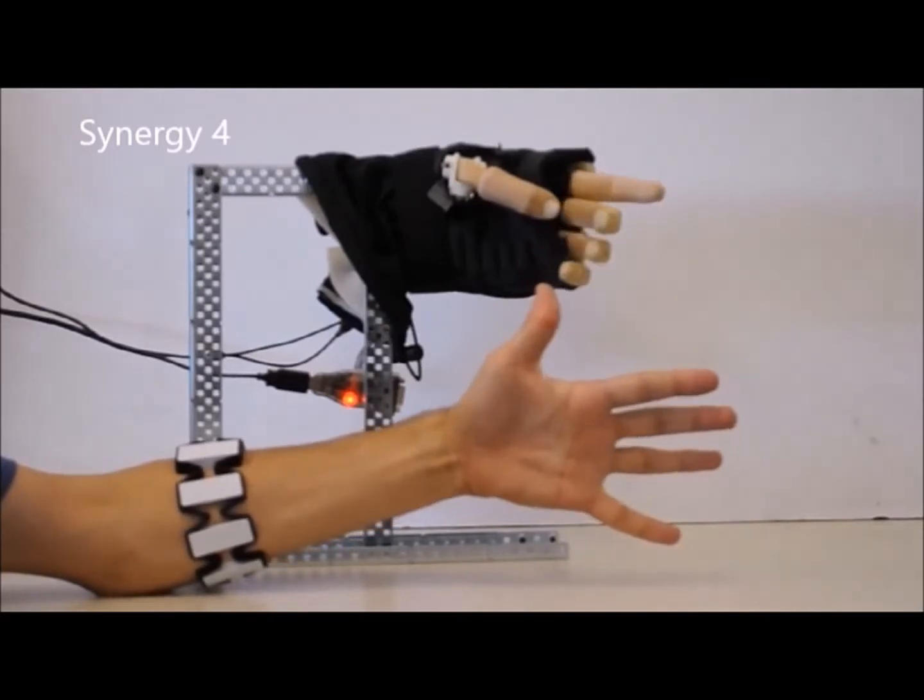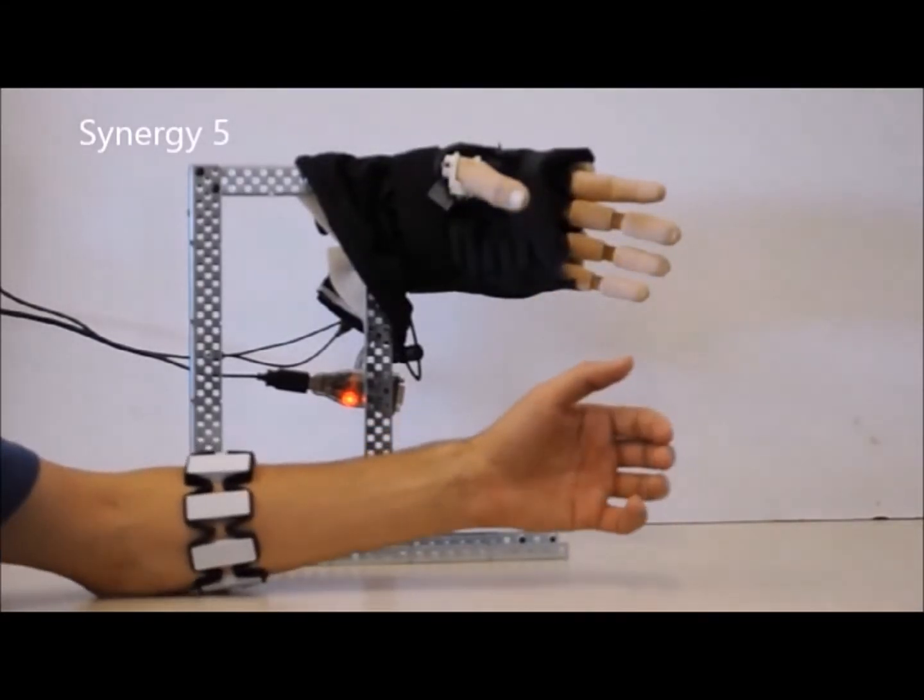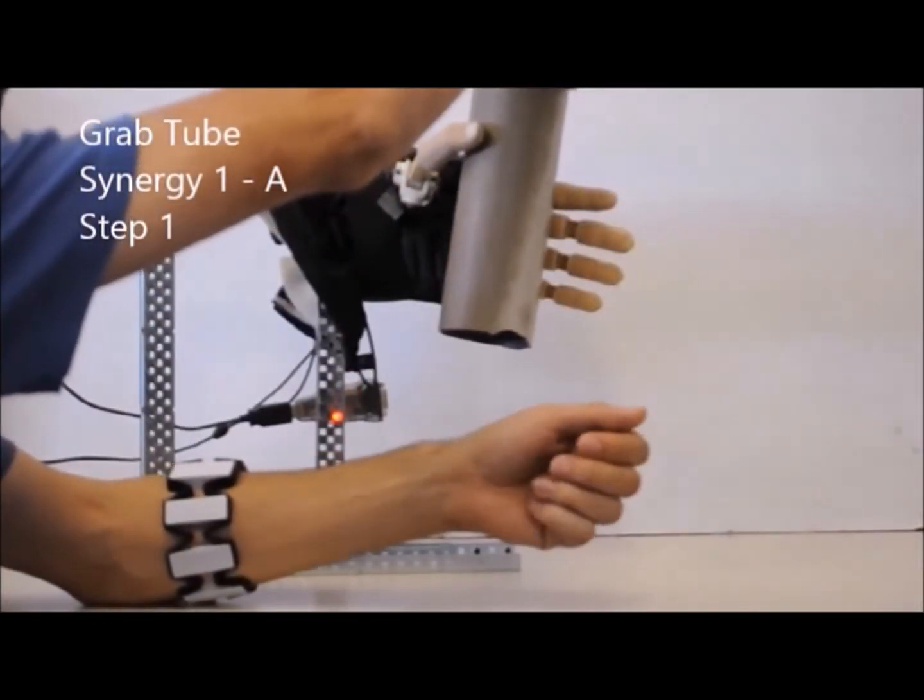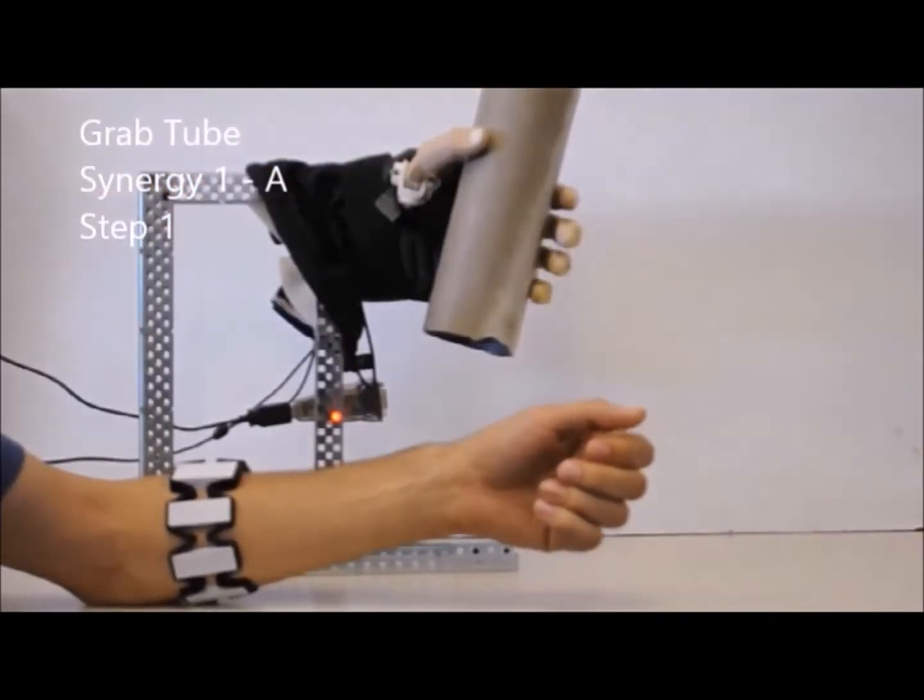Each synergy is basically the trajectories defined for each of the actuators from the start point to the end point. The first synergy is composed of four intermediate steps from the start to the end point.